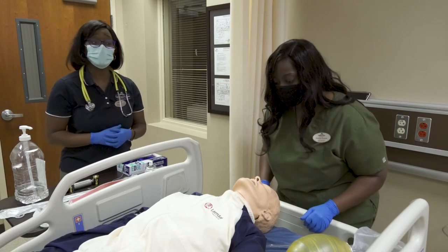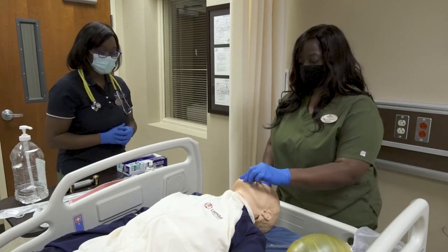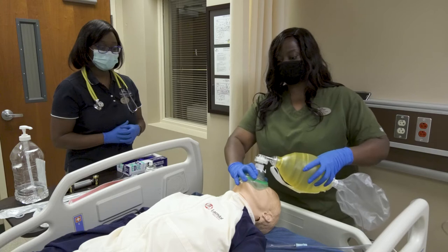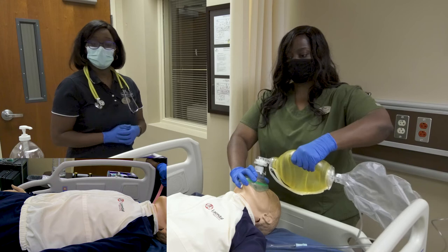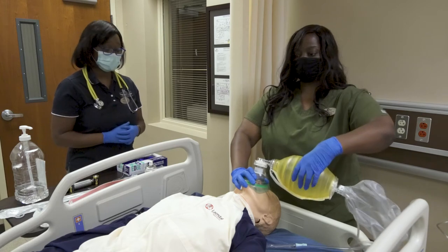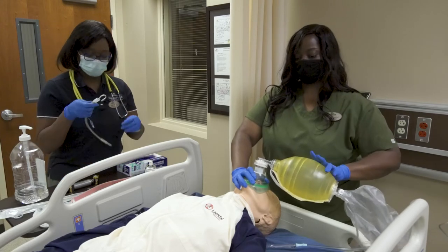Make sure your patient is positioned — put the head in a sniffing position, making sure you do not hyper-extend the neck. Remove any dentures. First, you want to ambu your patient, looking for good chest rise. You and your assistant will assist in this procedure.